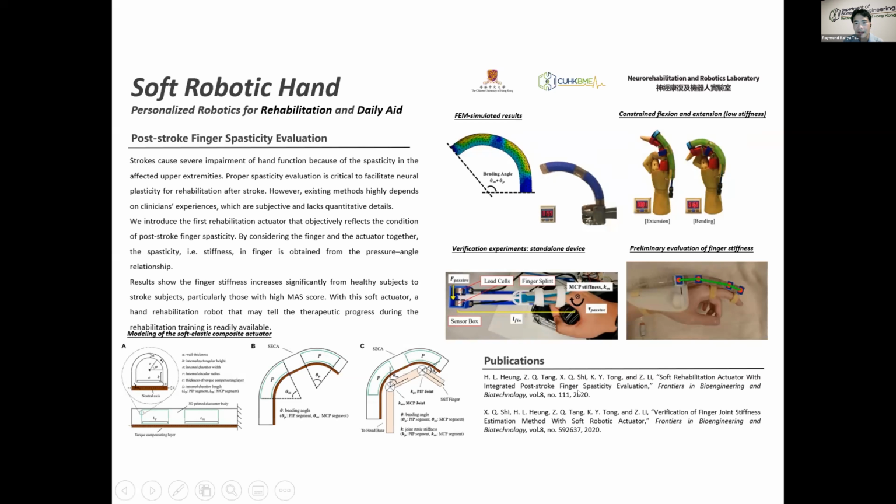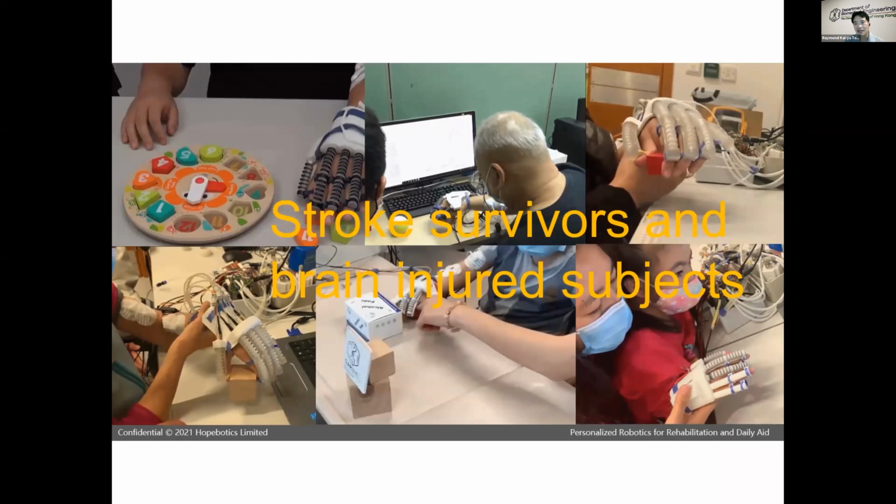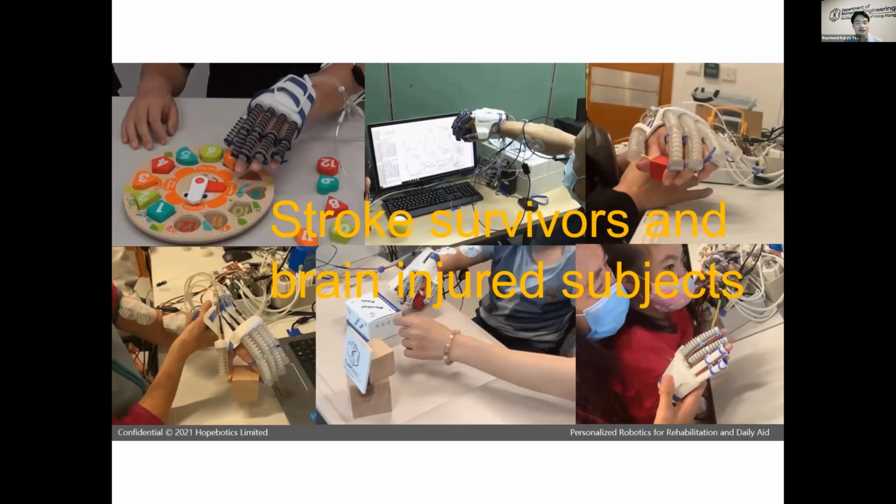And the beauty of this is that we can also evaluate the spasticity of the fingers, because when we move, we know the movements, and we can also measure the pressures. We can estimate the spasticity level from our system, which we haven't seen in other systems. So now we can control the robot under finger spasticity. At the same time, we can also do some clinical assessment with our system. So let's see some of the videos to see how the system works.